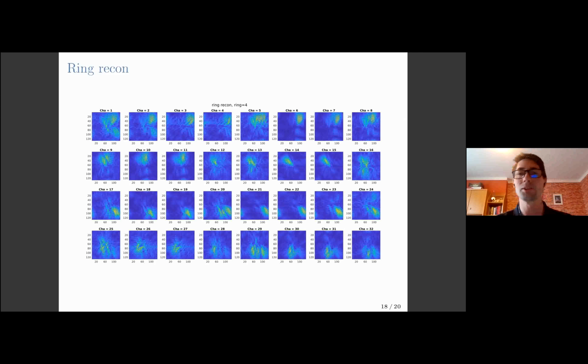So there are some channels very sensitive in particular quadrants of the K-space. So possibly if we combine all of them in those columns, then we can find that they are quite sensitive to rotations, and then they can show us how the intensity changes when the patient's head is rotating.